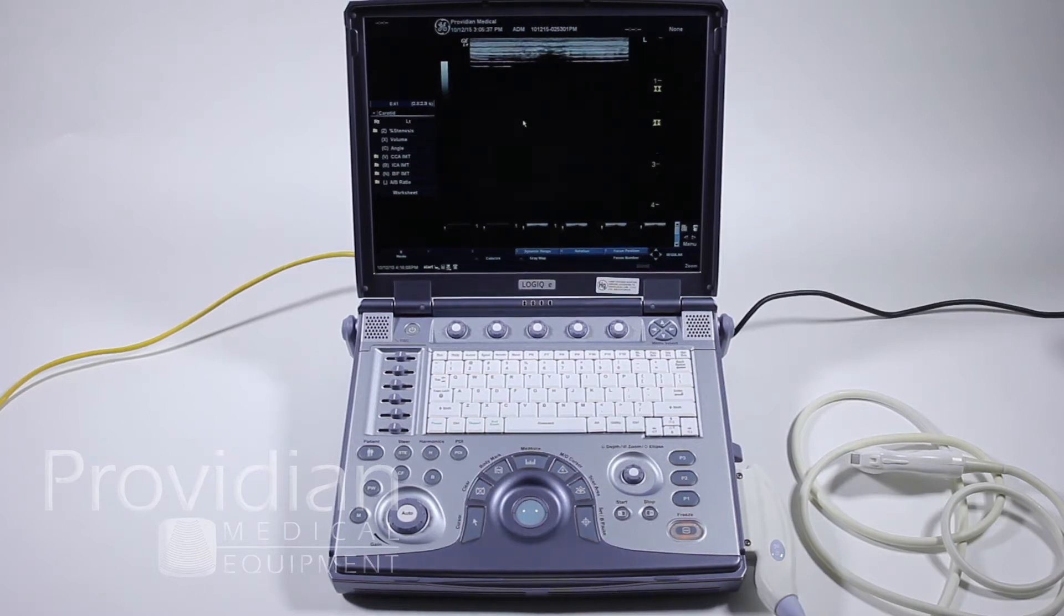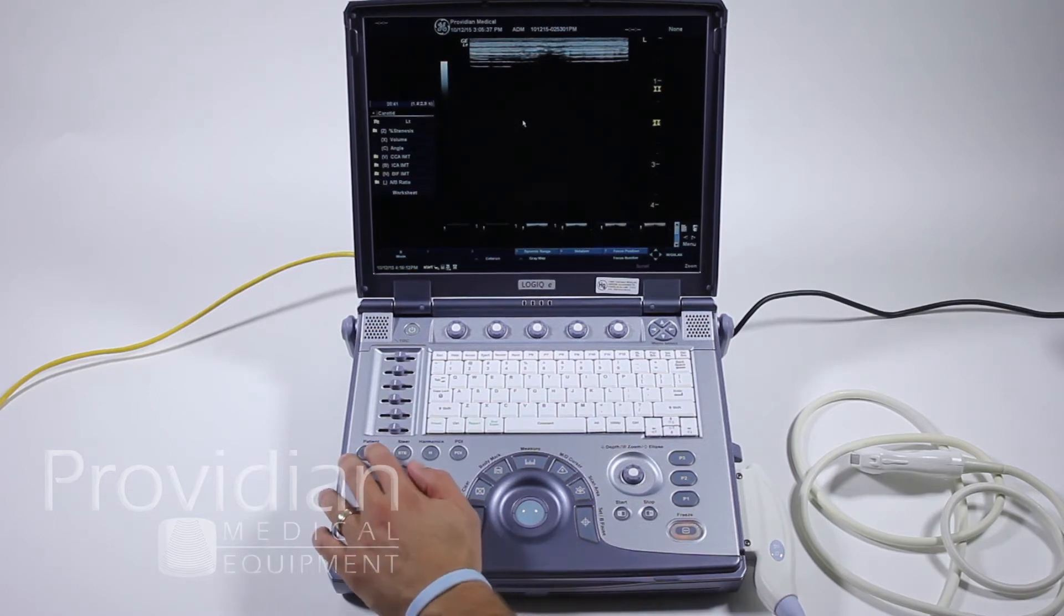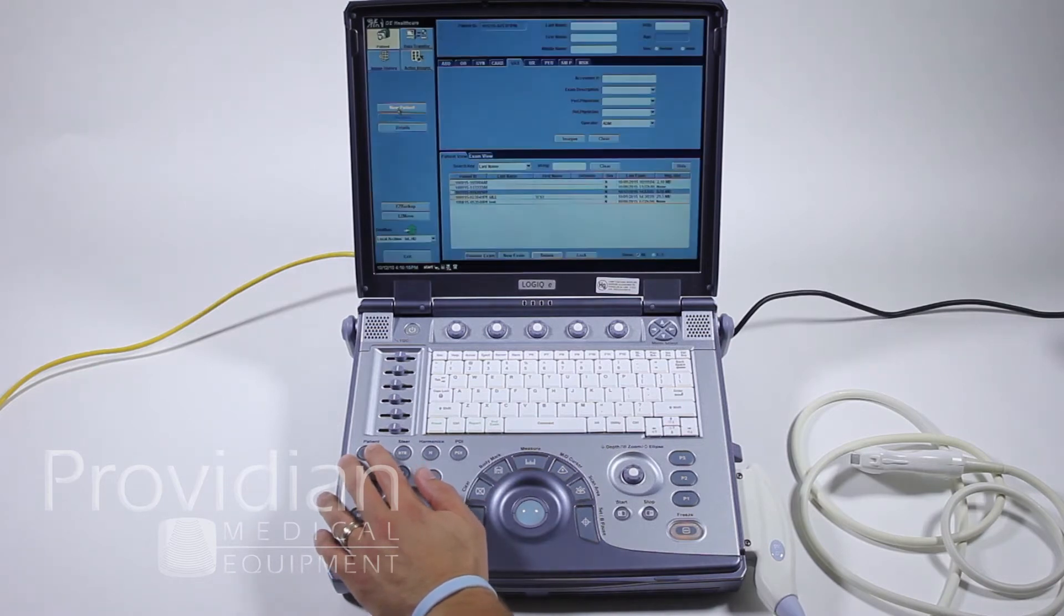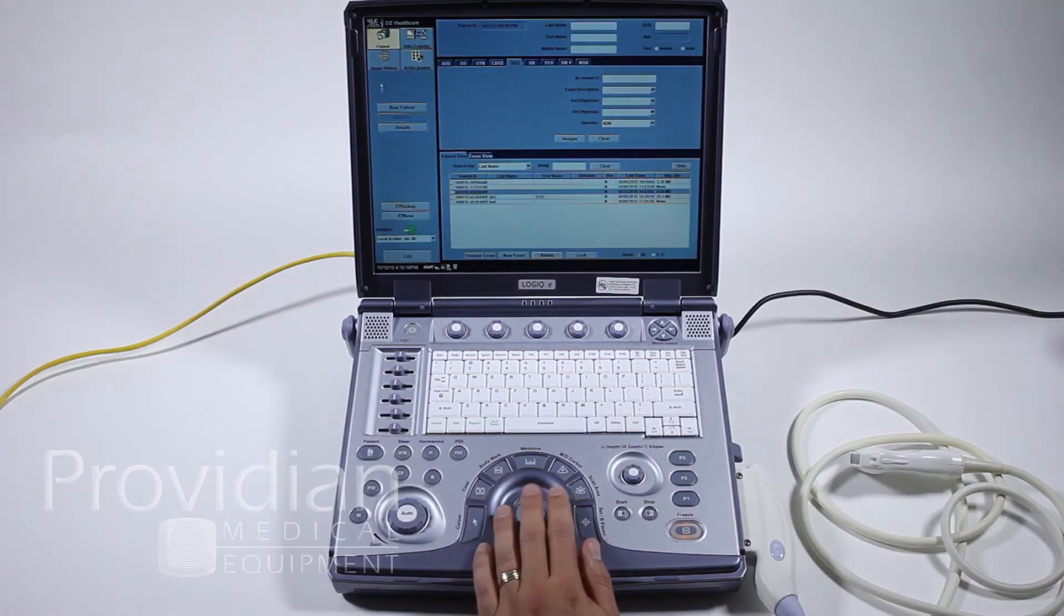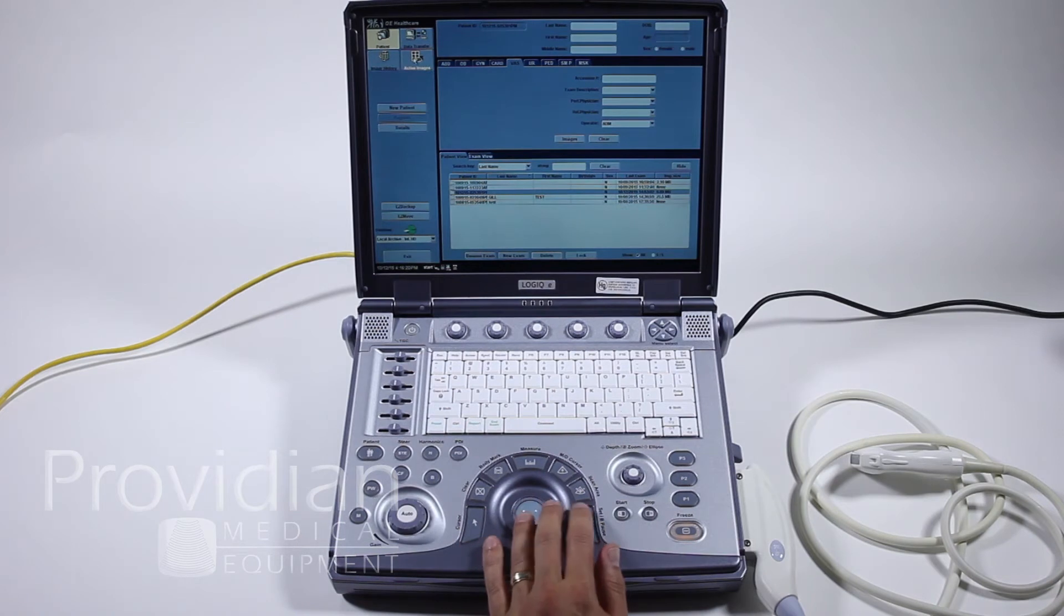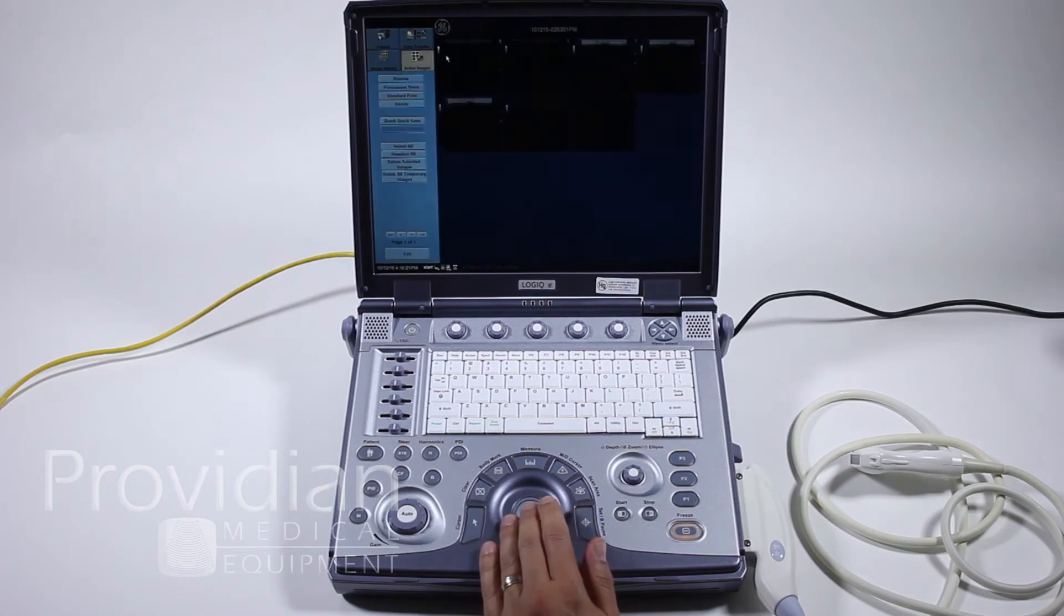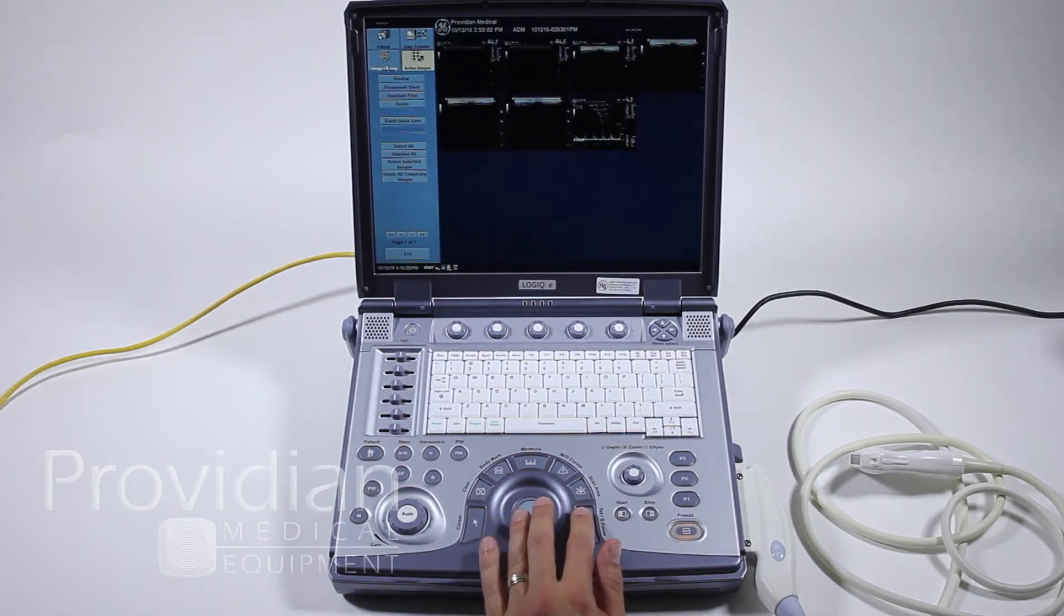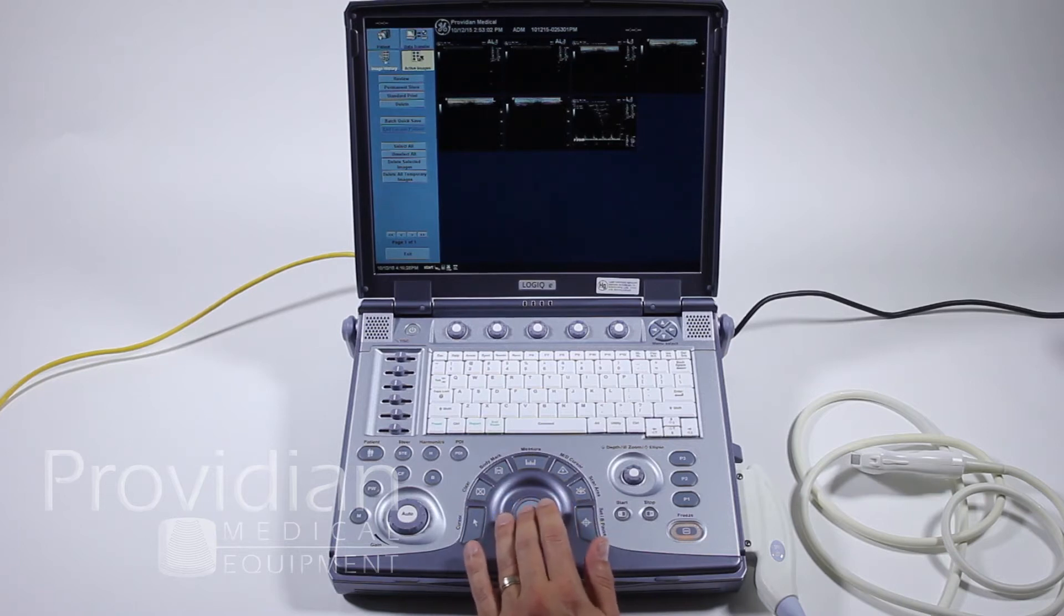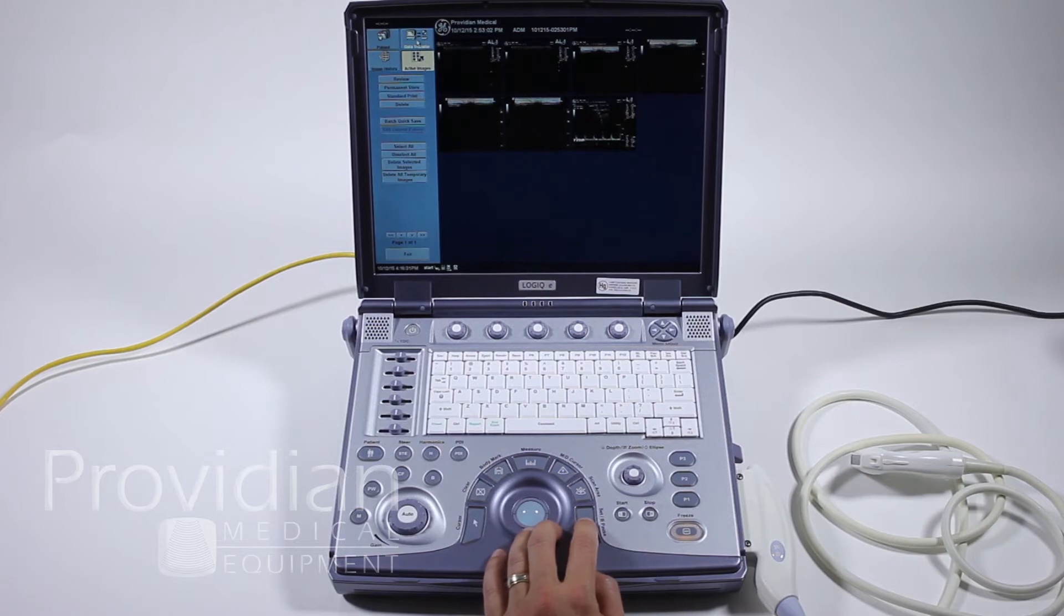The first thing we'll do is go to the patient screen. Up here in the left-hand corner, we have some choices. This shows the active images for this patient, image history for that patient. I don't have a history, so this is all we'll see. We want to try data transfer.